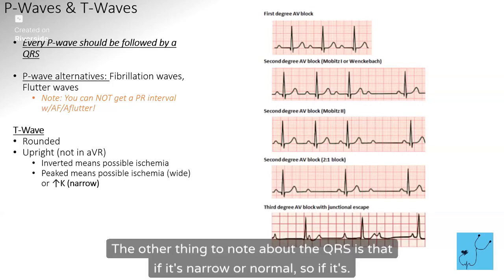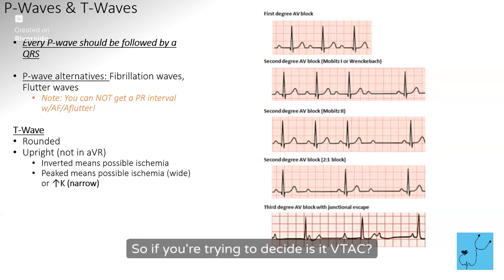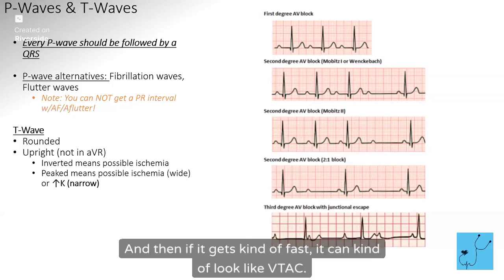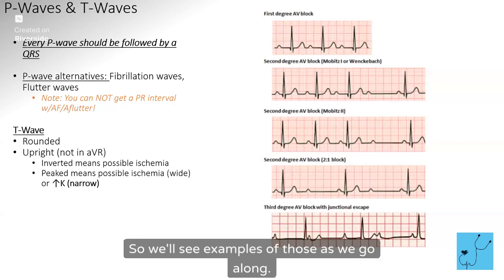The other thing to note about the QRS is that if it's narrow or normal, so if it's 1 or 1.5 boxes, it's atrial. It's coming from the atria originally. If you have a wide QRS, it's coming from the ventricles. So if you're trying to decide, is it VTAC, is it SVT? Sometimes someone might have a left bundle branch block where they have a kind of wide QRS, and then if it gets fast, it can look like VTAC. So you have to measure, and then you have to look for the P waves sometimes to differentiate between the two. We'll see examples of those as we go along.